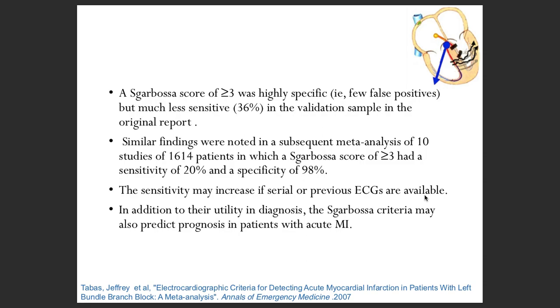Yeah, please. In one of the earlier slides, it says discordance equals good equals secondary, and then concordance equals bad equals primary. What do you mean by secondary and primary?